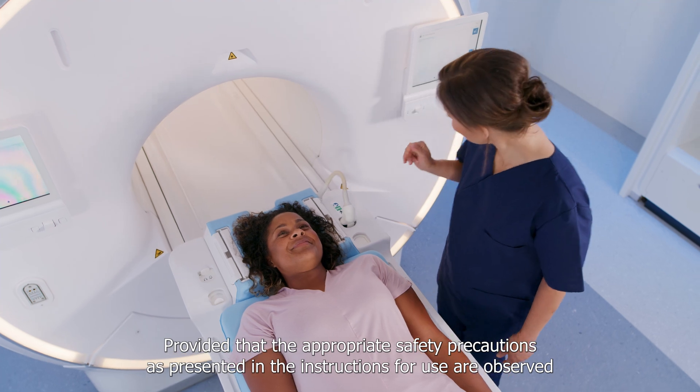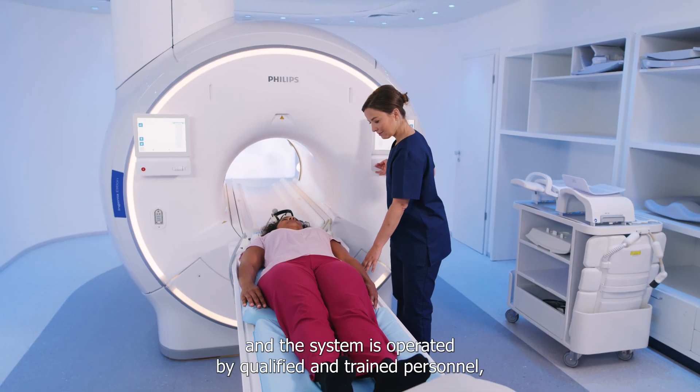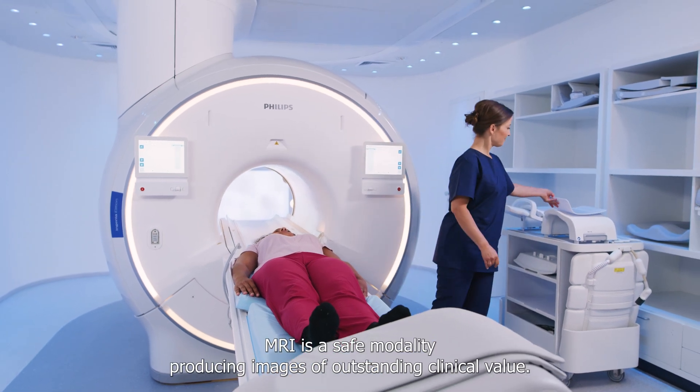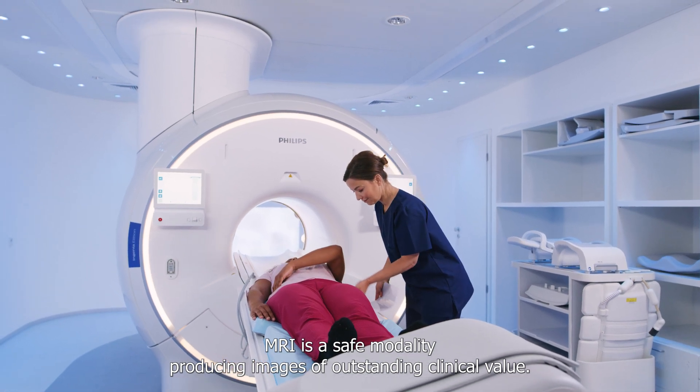Provided that the appropriate safety precautions, as presented in the instructions for use, are observed, and the system is operated by qualified and trained personnel, MRI is a safe modality, producing images of outstanding clinical value.